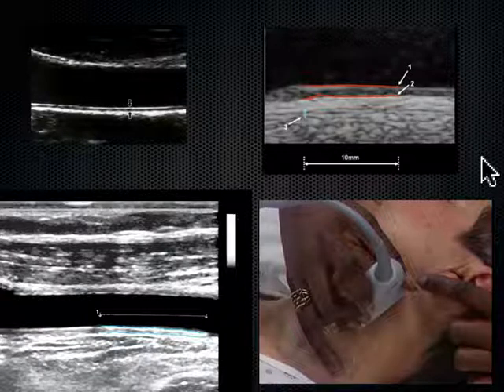CIMT. Any questions before we change gears one final time? Just something to introduce you to. And when we look today on the models, it's just a linear echo. You can't even see a separation because everybody's so young and healthy, okay? But when you take this machine out to preceptorships or clinics, wards on older patients, you will start to see these thicknesses come off the screen.